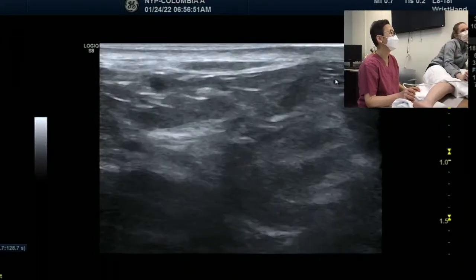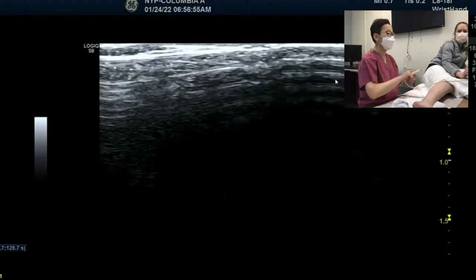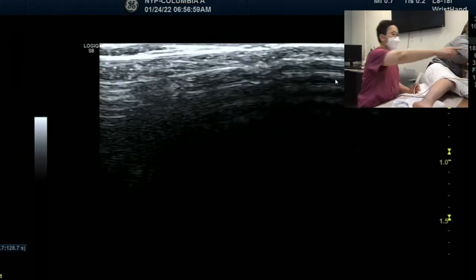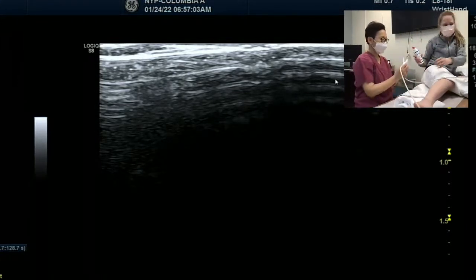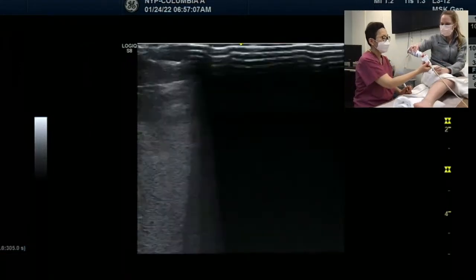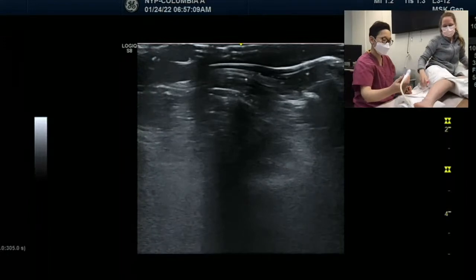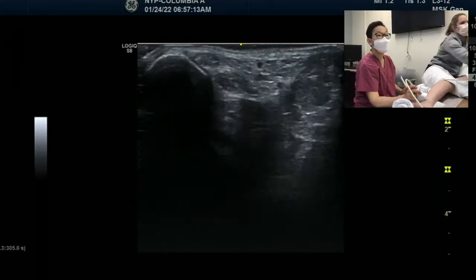For me to show you everything, I'm going to move to a different probe. Is it a clean one? Yeah, I was just going to put gel on it this morning. So let's give a little more gel. Let's orient again, and then less depth. Good luck.